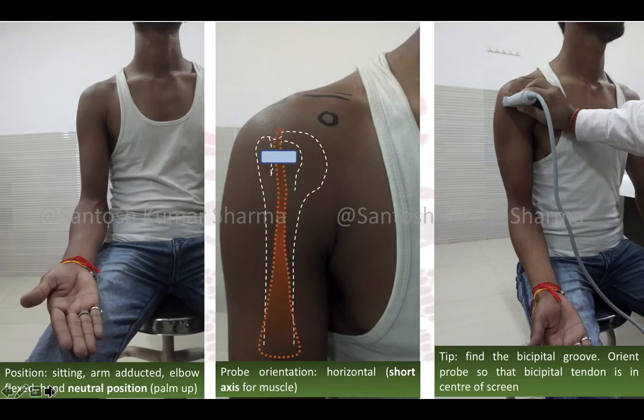This is the normal position of the patient, and the patient basically sits on a stool with his arm adducted to his chest. The elbow is flexed at 90 degrees and the hand is held in neutral position, which is basically supination, and the palm is facing up. After having done so, we visualize the bicipital groove and palpate it, and then put the probe horizontally, which becomes short axis for the tendon. And once this is done, we orient the probe so that the tendon is visible in the center.